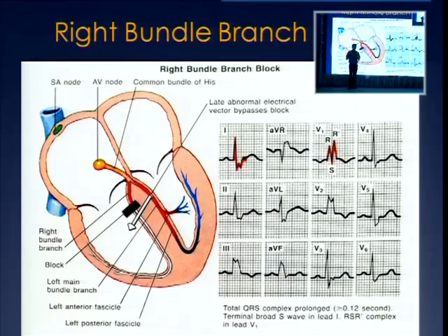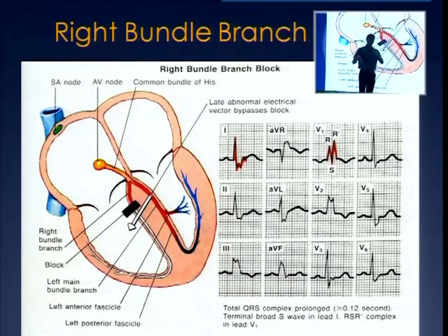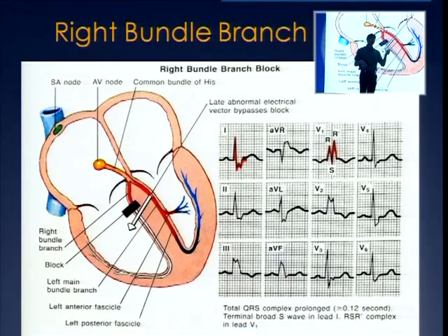Okay? And similarly, if you get a bundle branch block with the left bundle branch morphology, it originates from the right side, because the right side gets activated first and then the left. Does that make sense? You understood?